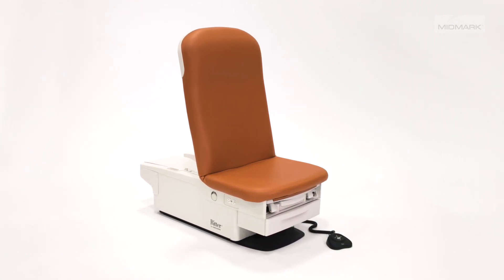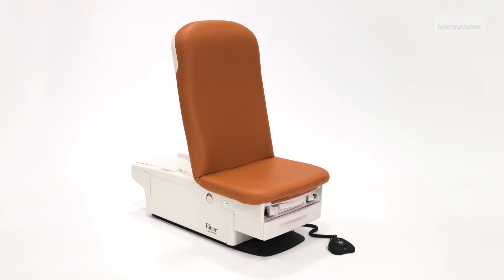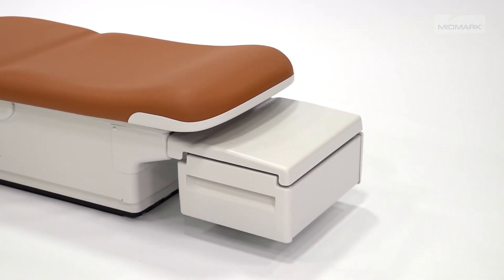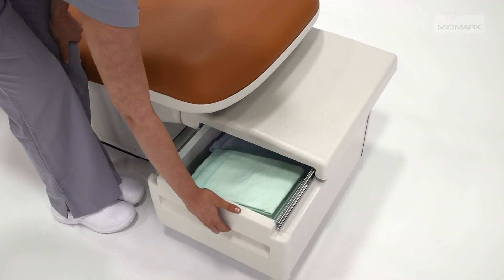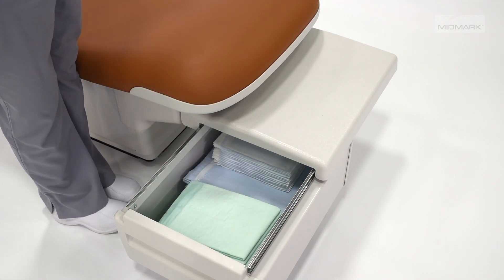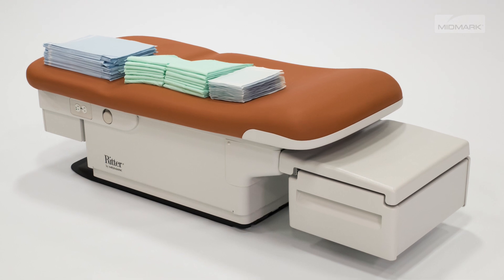Ritter Barrier-Free Exam Chairs are designed to be easily enhanced with a variety of accessories to fit the specific needs of your patients and practice. The Supply Assistant Drawer is intended to be a simple way to add storage to your Ritter Barrier-Free Exam Chair. The drawer can be attached to the back of the exam chair for quick access and to provide extra storage space for bulky exam supplies such as drapes and gowns.